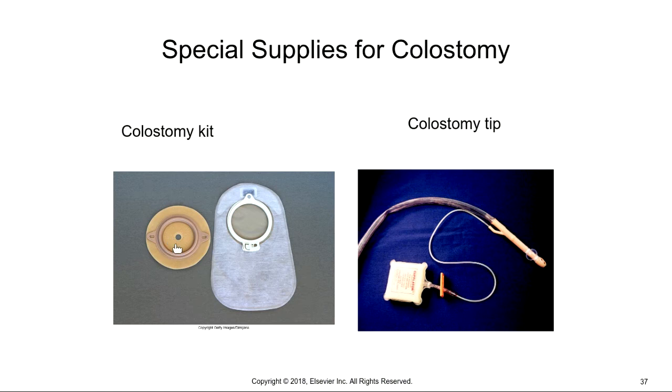So this stays on the patient. The little piece of intestine comes out through that hole. You would put the enema tip into that section of bowel, and then you or the radiologist will put the contrast media in and take pictures. Once you're done, you take that tip out. You would clean this area off, and then this bag right here, this white ring, attaches to this flesh-colored ring right there.